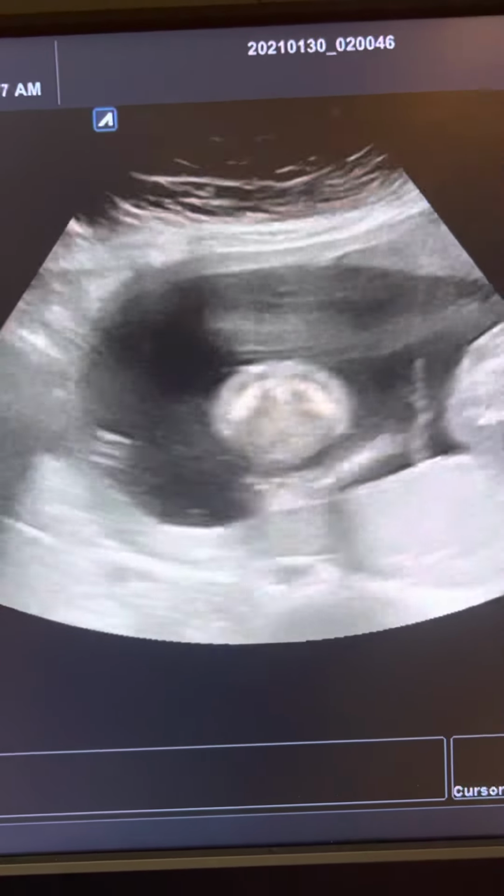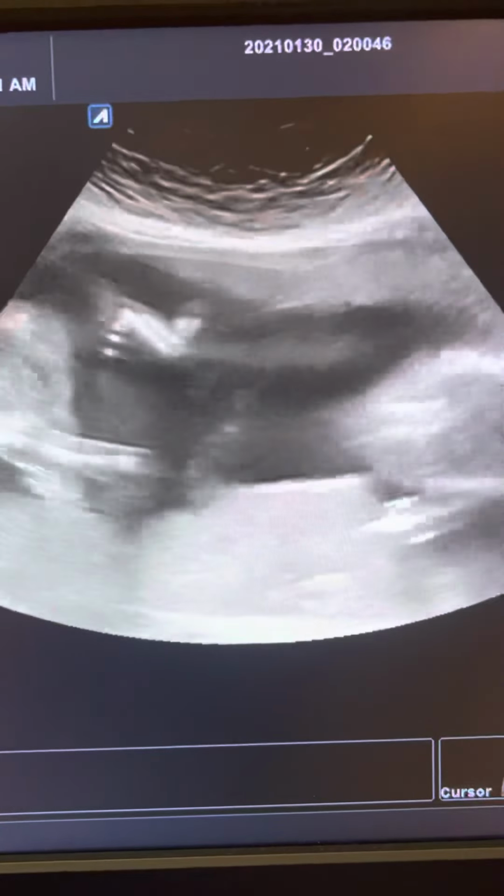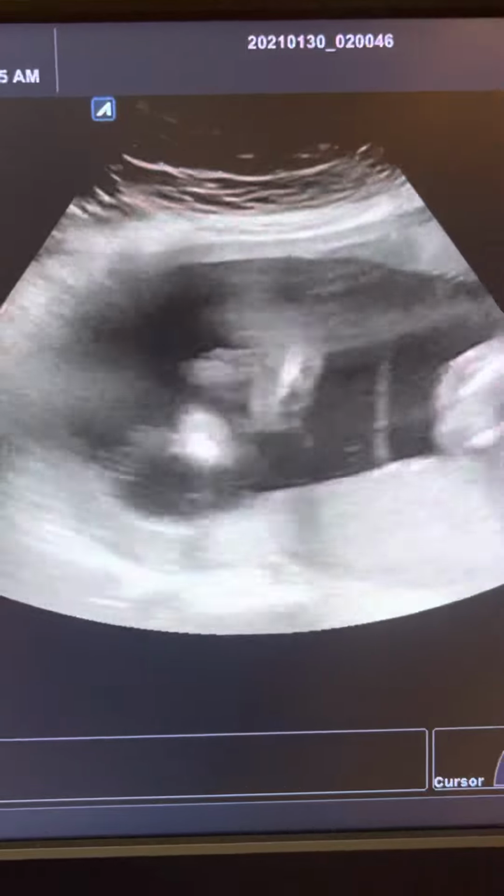Hello, I'm Dr. Atsai with a new case on sonography. We have a triplet pregnancy for anomaly scan.